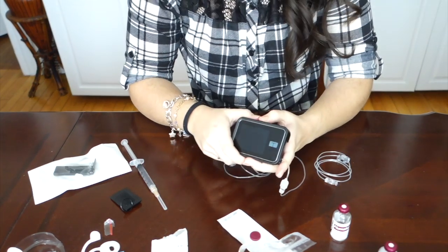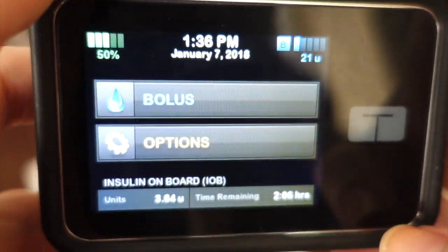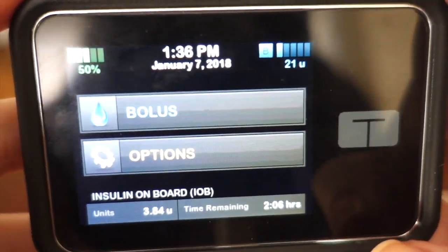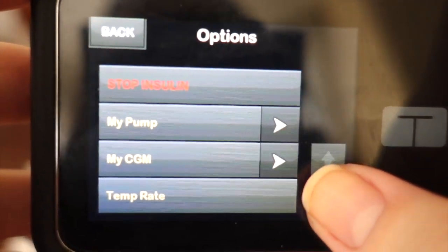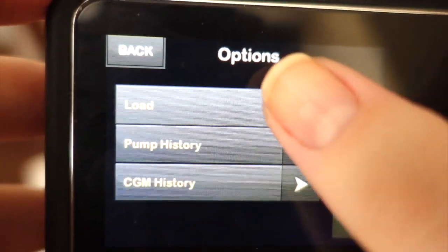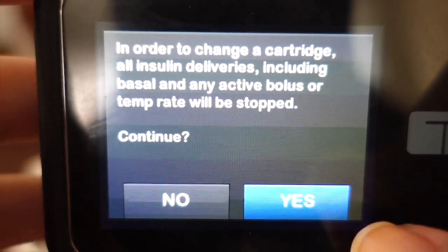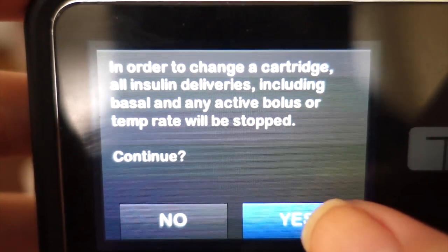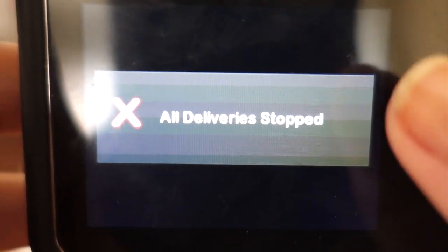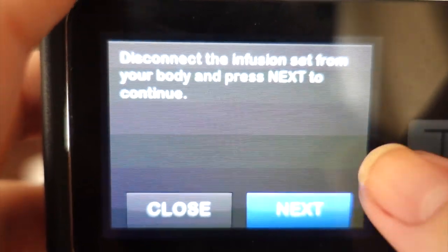I'm going to take the pump and unlock it. Once you have your syringe ready with the insulin, you're going to go ahead and go into Options, scroll down once, go to Load, then Change Cartridge. In order to change the cartridge, all insulin deliveries including basal and any active bolus or temp rate will be stopped - so just press Yes. All deliveries have been stopped. It says to disconnect the infusion set from your body and press Next to continue. We've already done that, so just press Next.